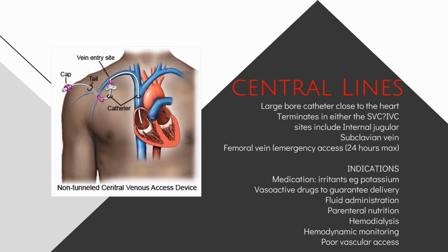So anyone on vasoactive drugs should actually get a central line, and it is very important for the nurse to remind the doctor, be an advocate for your patient and remind them. Once you've started inotropes, you actually need a central line to be inserted. Fluid administration is definitely another reason to put in a central line. With the large bore, you can deliver it much faster.